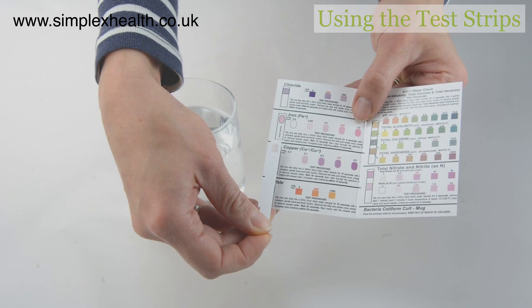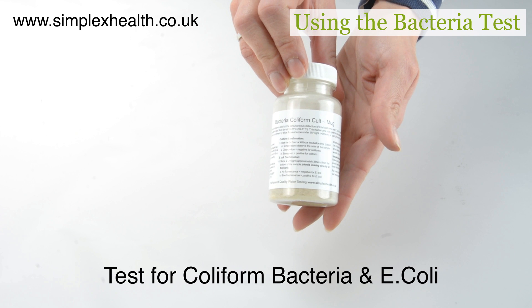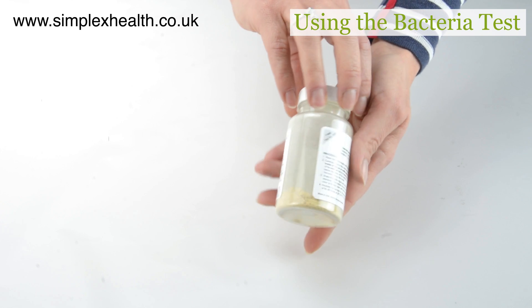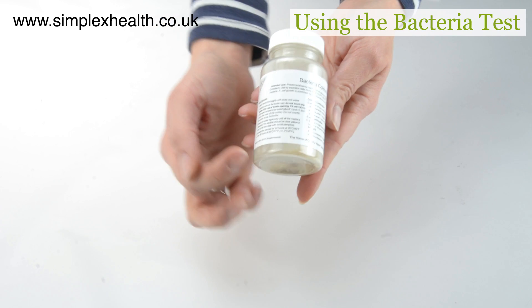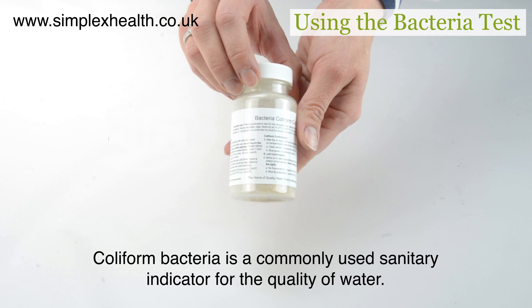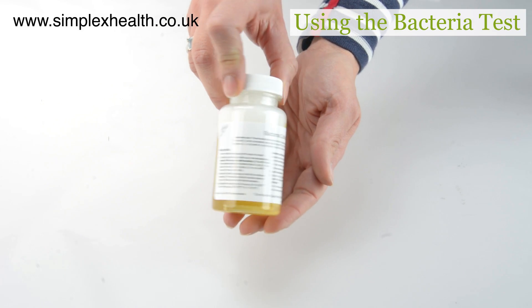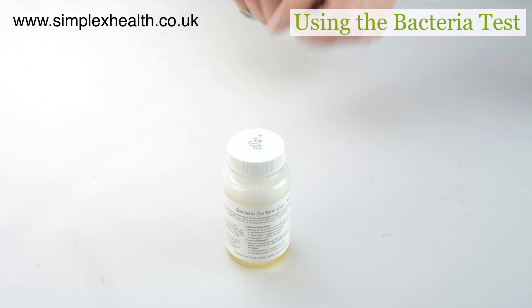The total coliform bacteria test uses a growth powder, which is a commonly used test method by laboratories and water suppliers. Make sure that you carefully read the instructions on the bottle before starting the test. Once the mug has been filled with the water sample, put it in a warm place with a constant temperature for 24 or 48 hours and do not disturb it during that time. After the incubation time, the color change of the liquid in the bottle will indicate either a positive or negative result.